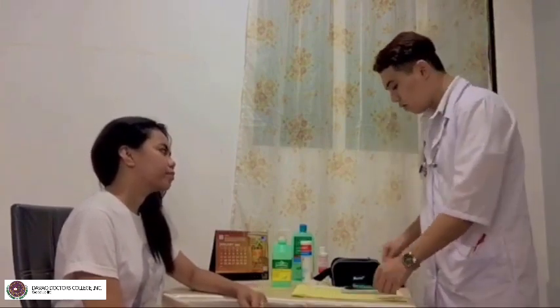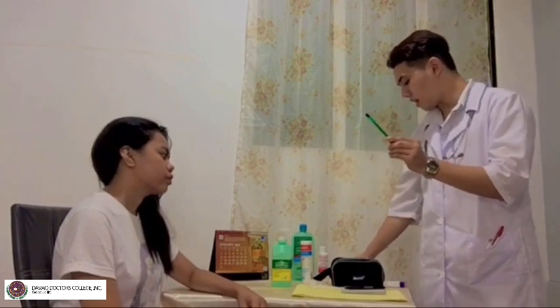So, now, we need to sanitize this imaginary oral thermometer. So, using a wet cotton, first sanitize the tip of this oral thermometer to its stem, like this. And then, after the wet cotton, we are now going to use the dry cotton and repeat from tip to stem. Okay, so guys, this is just an imaginary oral thermometer.